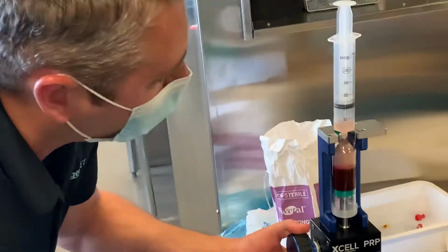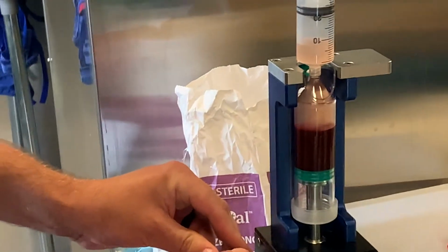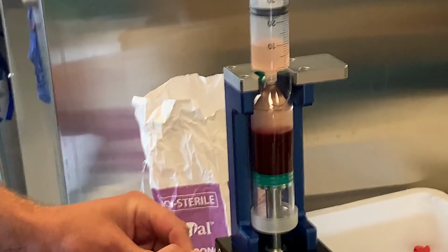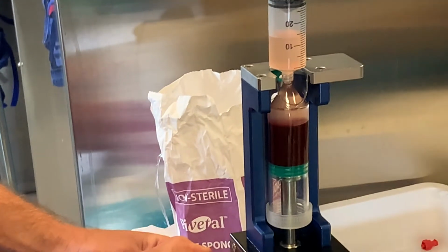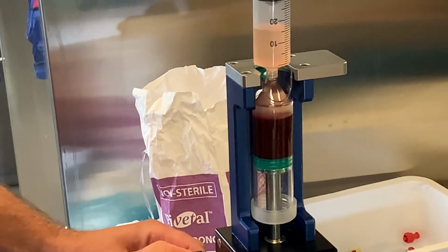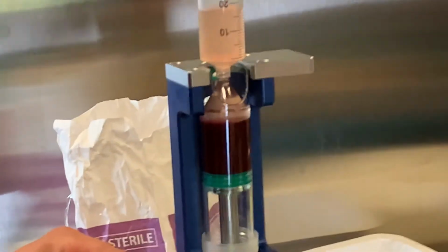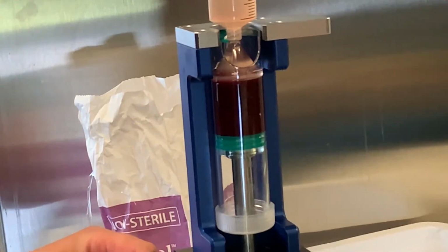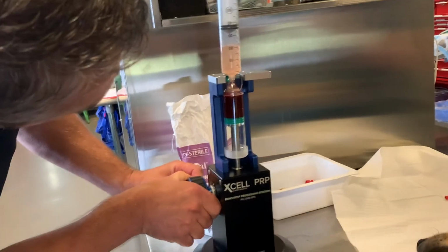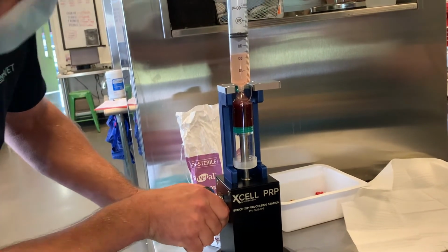So we usually bring the buffy coat right up to the 6, I'm going a little bit slowly here, but we're going to go past that just a smidge. Okay, because we had less than 60. Yeah. And by doing that, we're going to get a higher concentration of platelets in that 3 or 4 mLs volume we get. There we go. We'll just leave it at that.